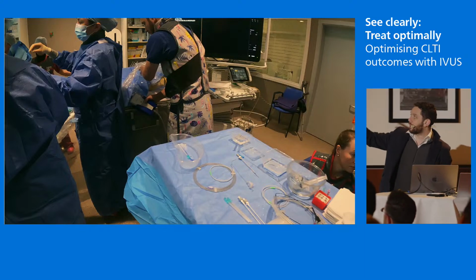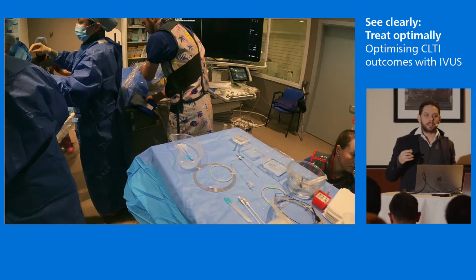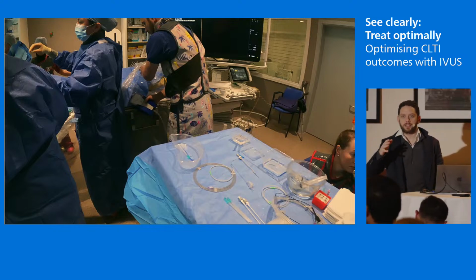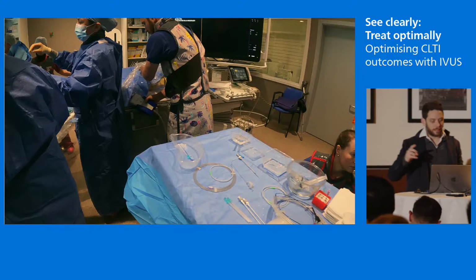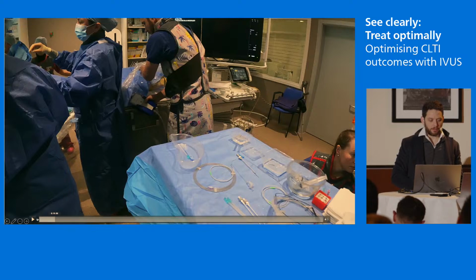So if you're going to have another machine, an IVUS machine, you need to have thought about it a little bit earlier. And probably echoing what these guys do, with the complexity of our angio or hybrid cases, if we're starting to open lots of kit, we open IVUS as well to make sure we use the right kit and use it to its best potential and safely. I think this was a case where we knew we'd probably end up having one and maybe 2 bites of the cherry.